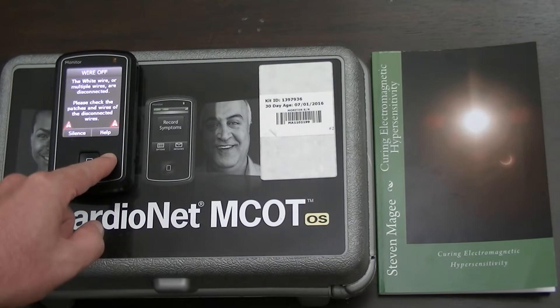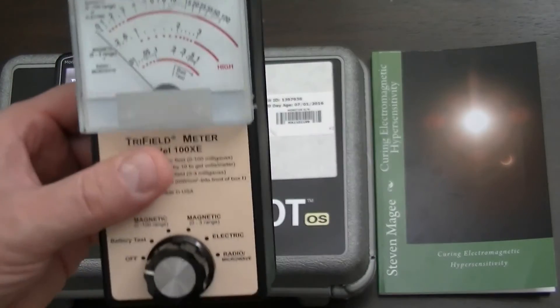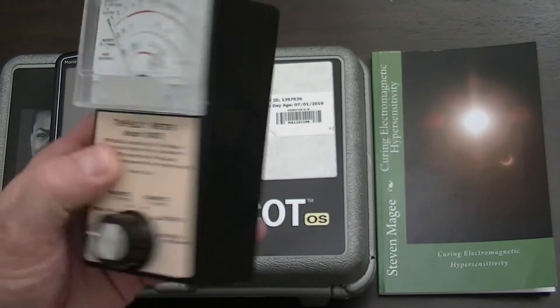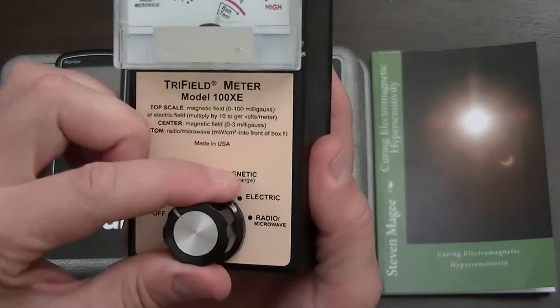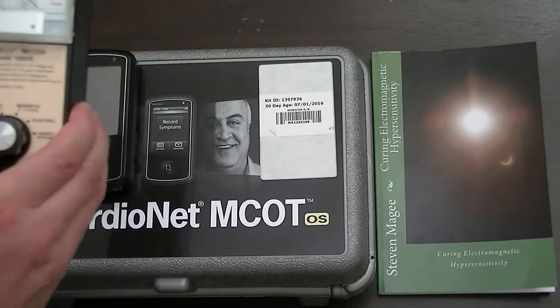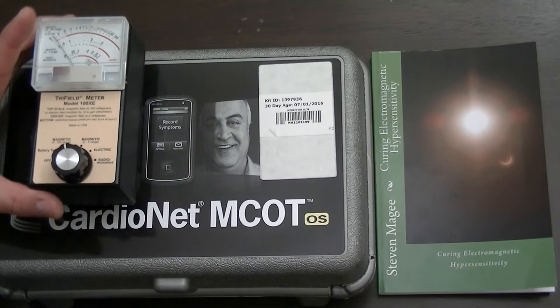We're going to test it with a number of electromagnetic field meters and we're going to start with this one. This is a Trifield 100XE. Many people who research wireless radiation use this meter. We're going to start with a magnetic field reading on the 0 to 100 range. You can see it has an electromagnetic magnetic field emission from it, pulsing very regularly.